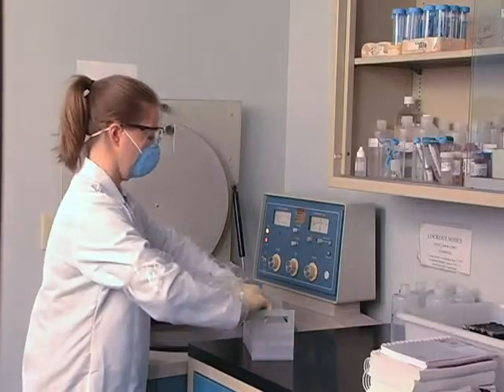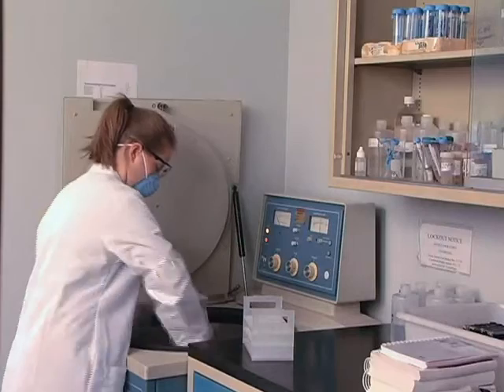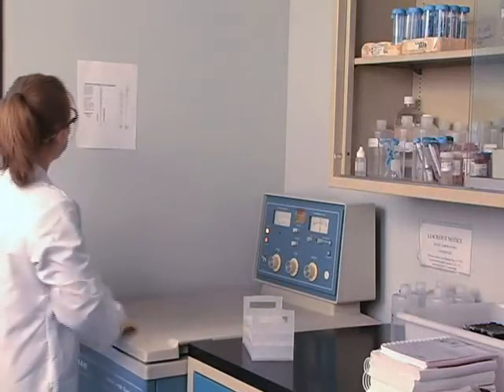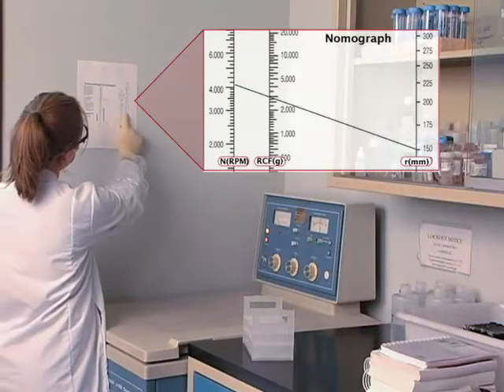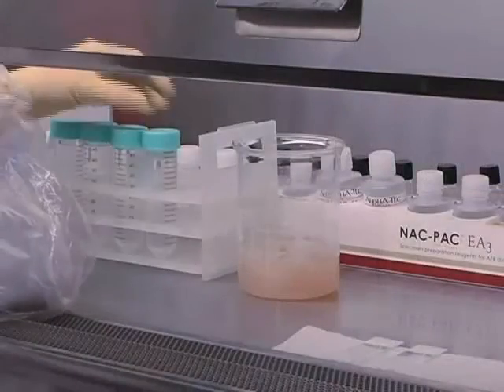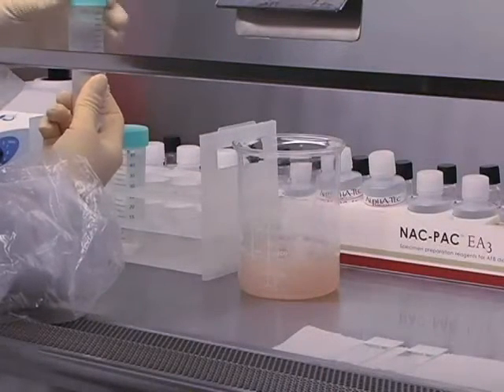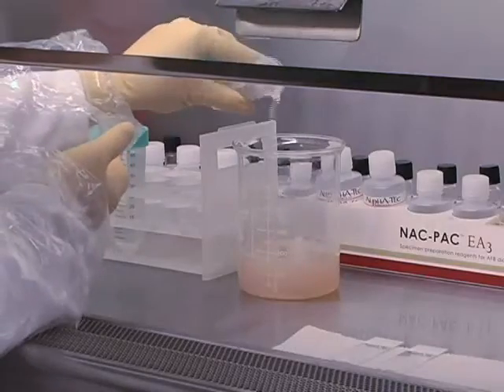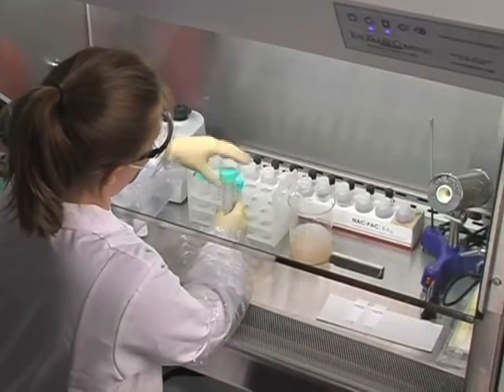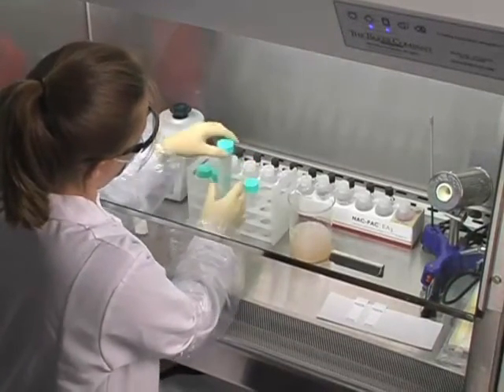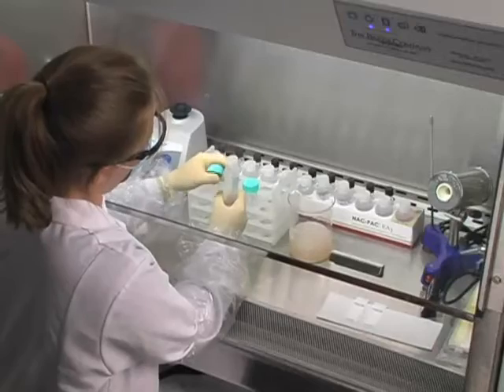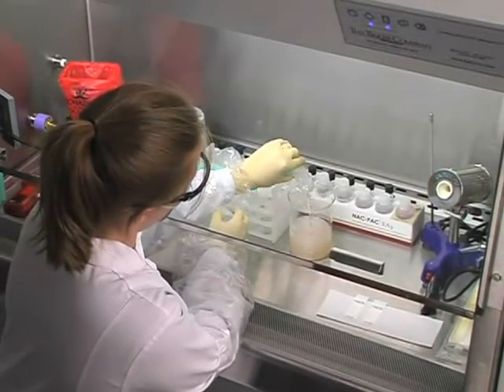Centrifuge the specimen tubes at 3000 XG for at least 15 minutes. Note that 3000 XG is not typically equivalent to 3000 RPM. You should use a nomograph or refer to the centrifuge owner's manual to determine what RPM is required to reach 3000 XG. After centrifugation, return the samples to the biosafety hood. Carefully decant all of the supernatant into a splash-proof container holding a proper disinfectant. Be sure to decant dry, as residual supernatant can negatively affect the sample pH. Wipe the lip of the tube with an appropriate disinfectant to prevent contamination. When decanting, be careful not to loosen the pellet.